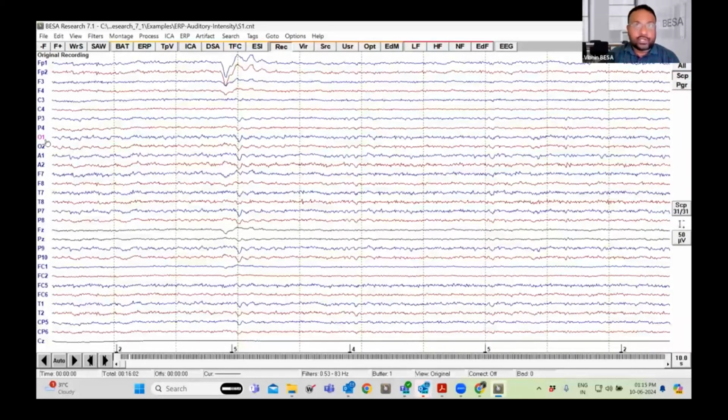Also, when you interpolate it, you need to make sure that it is not at the bottom of this chain of the electrodes. Because if it is at the bottom, the problem is that it might only take some of the neighboring electrodes' information. So it is better to take the maximum information from around all the channels. So please be careful when you are doing that at the rim of a chain.